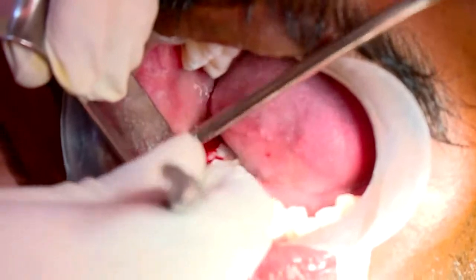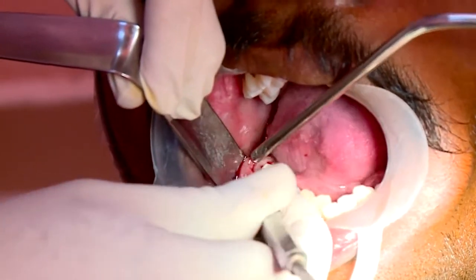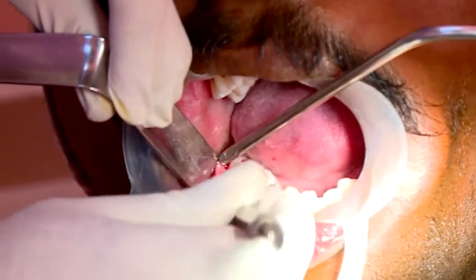For around 3 to 4 millimeters, you go cleaning the bone, and you give a little soft tissue release. Just slightly cut a little in the soft tissue. This will allow the flap to stretch more.